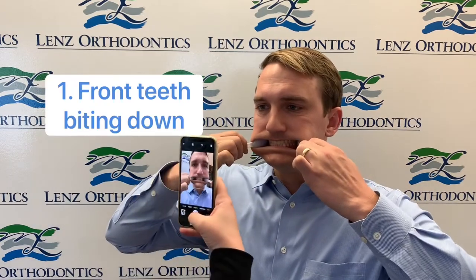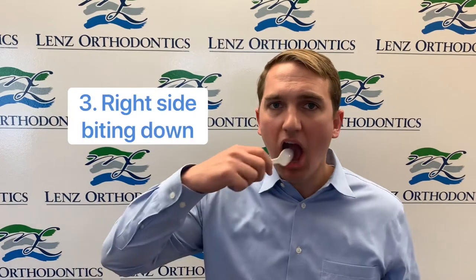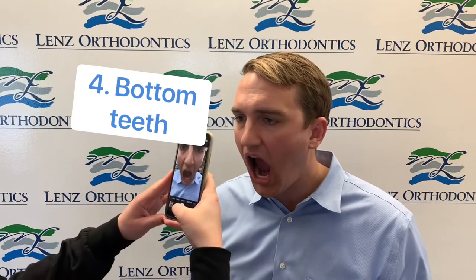Now we're gonna take pictures of our teeth. We're gonna use the two spoons, and we'll use the back side of the spoons towards our teeth. So that was the picture of the front biting down. Now we're gonna do the left side and the right, and the bottom teeth, and the top.